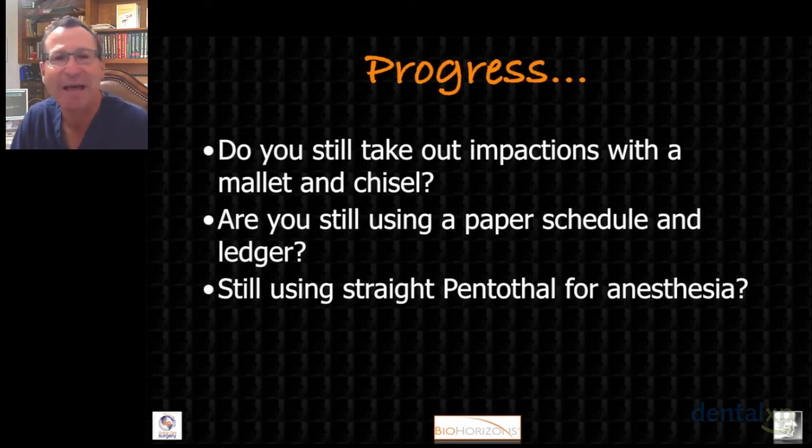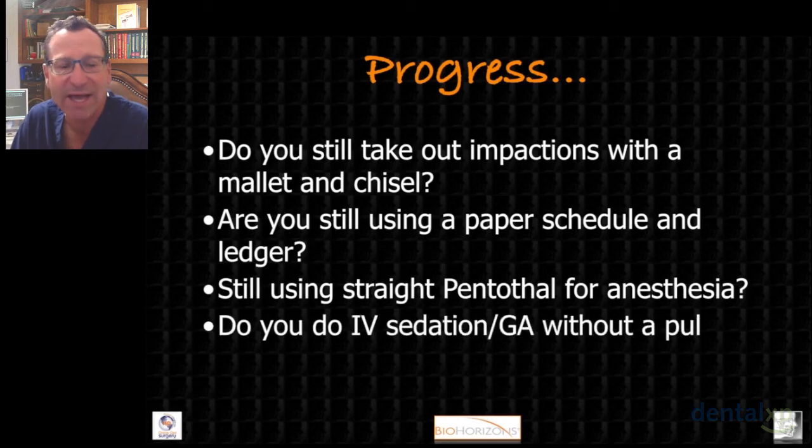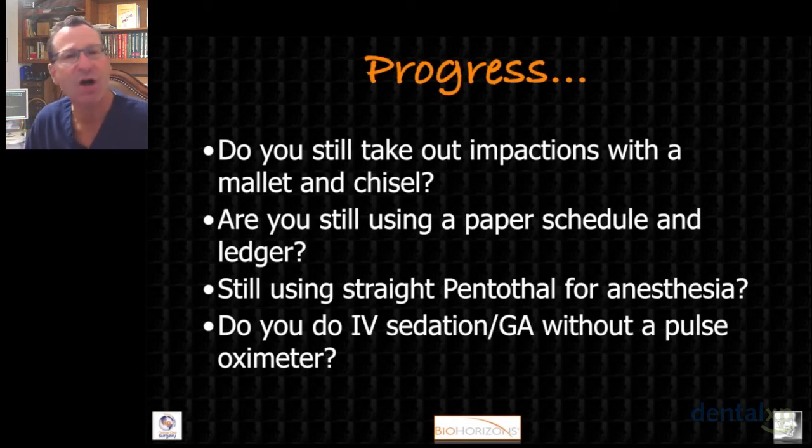No, you're using a balanced technique with propofol. And would you even think of doing sedation or general anesthetic without a pulse oximeter anymore? No. These are all changes in the techniques and protocols that were used since a lot of us trained, that have made treatment safer, more efficient, more successful.